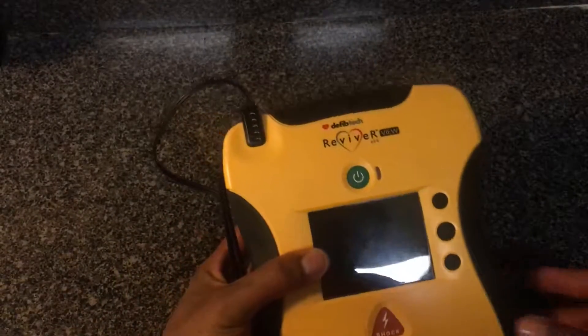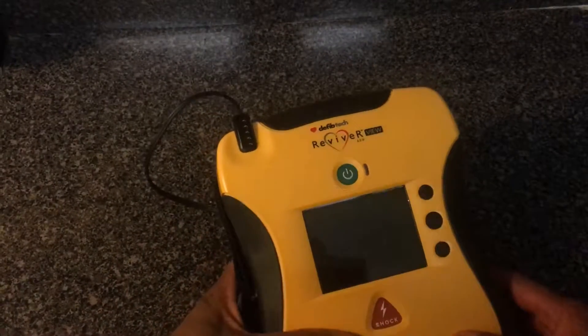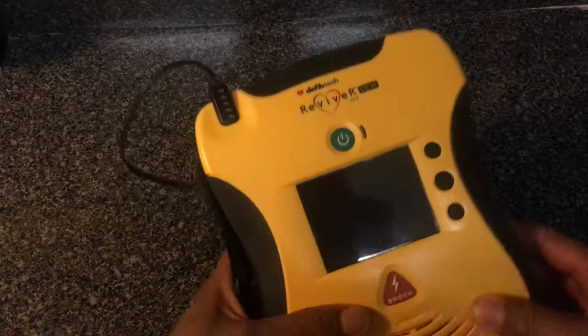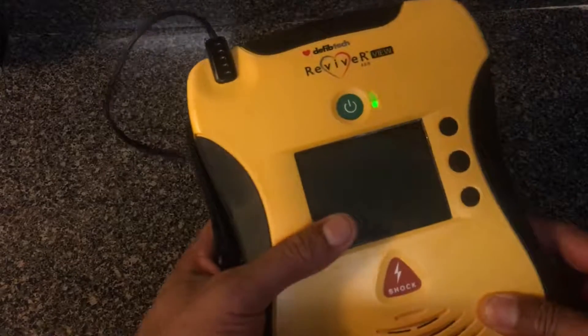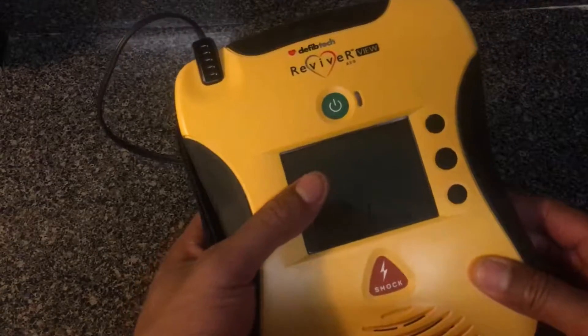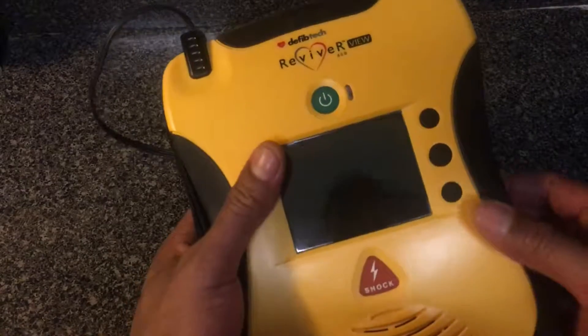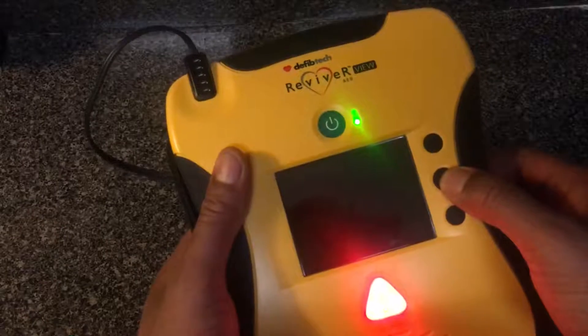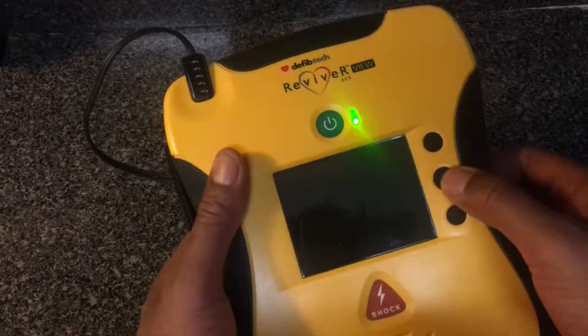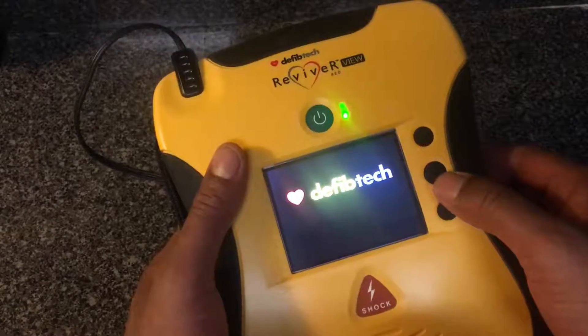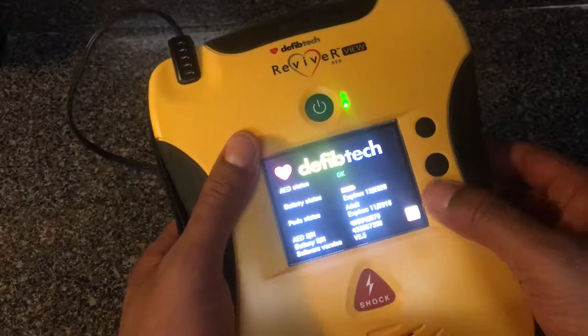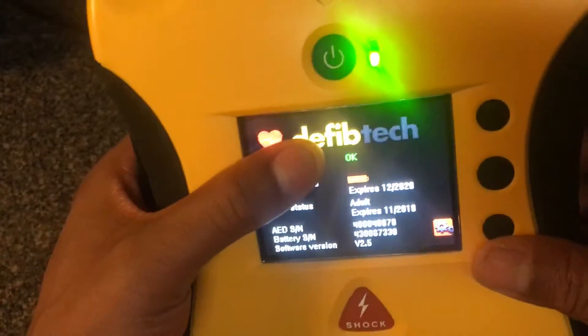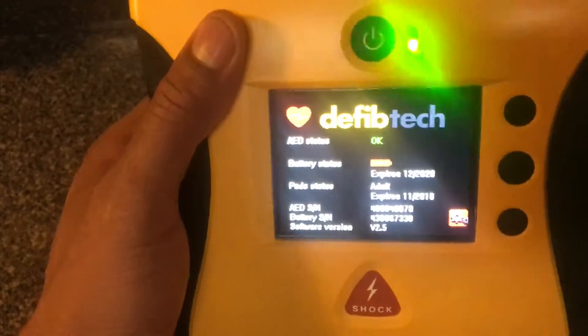Alright, today I am going to go through the menu of the Reviver View defibrillator. It's very simple. If it's powered up and the battery is good, all you have to do is press the center button right here.